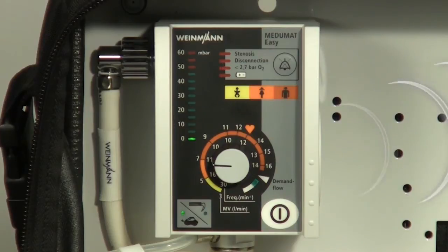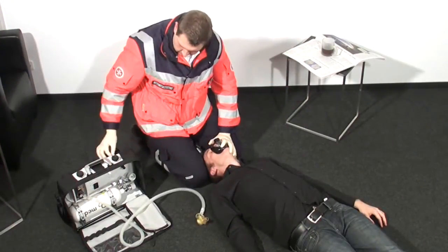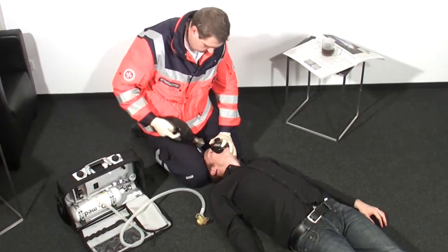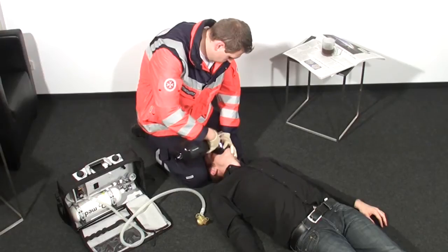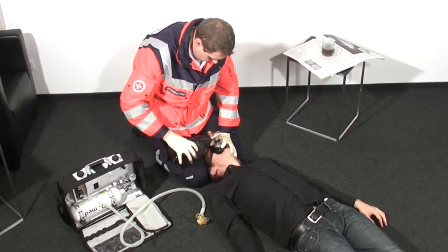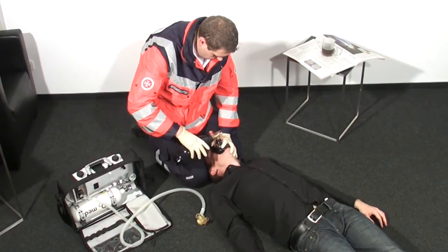When voice prompts are activated, a corresponding spoken warning will be given. To continue ventilation without interruption, switch immediately to manual ventilation with a bag valve mask resuscitator — for example, Vineman's combi bag — until the cylinder change has been made and Mejumat Easy is once again ready for use.